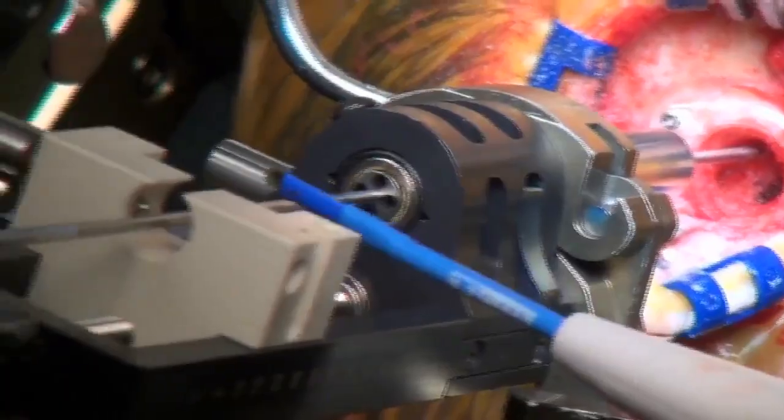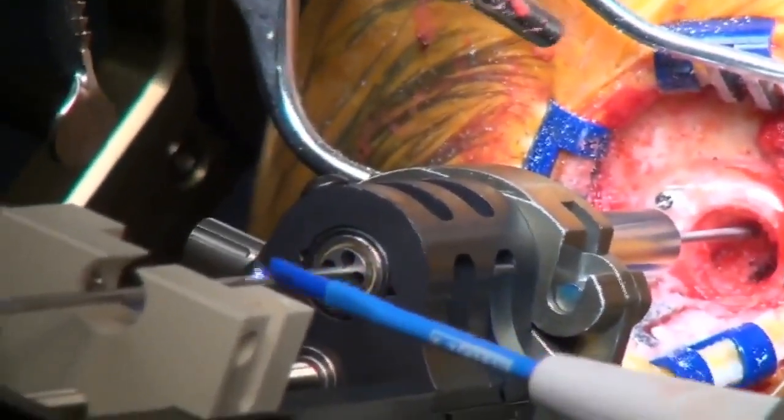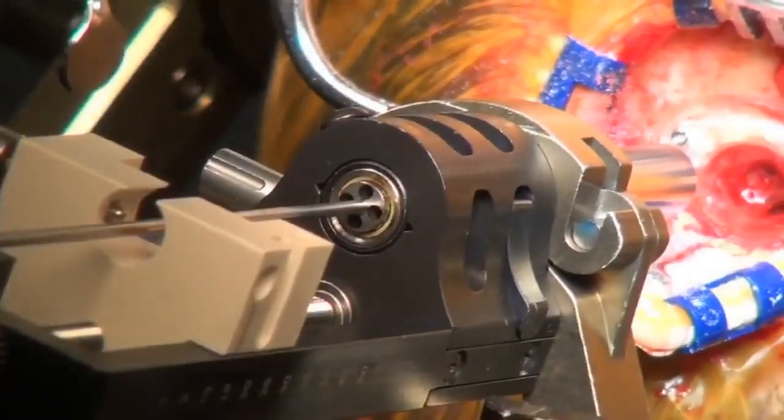So I'm going to use some electrocautery. Okay. Get that hole started.